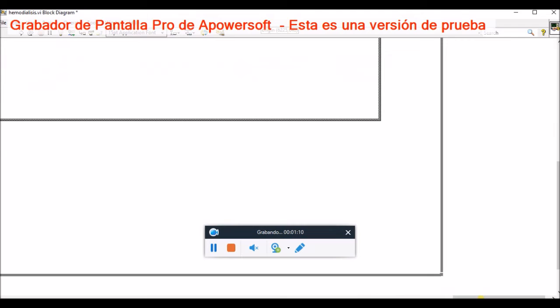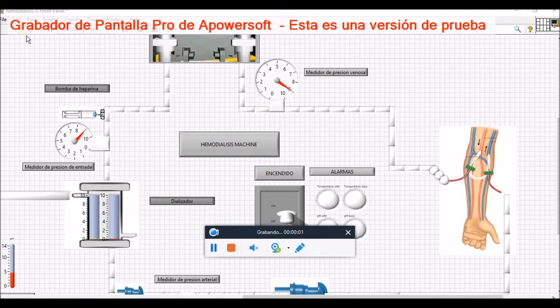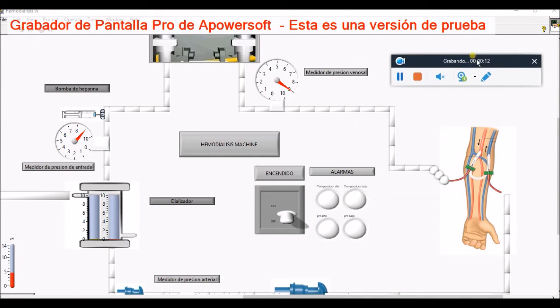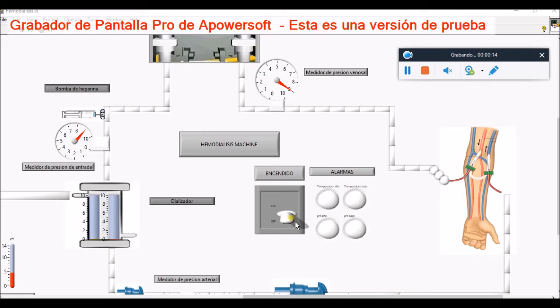Pressure sensors monitor the pre- and post-filter pressures. Adequate pressure must be maintained in the circuit to promote ultrafiltration and prevent clotting. The system will alarm if the pressure is too low or too high. Low and high pressure can indicate complications such as a clot in the filter or an occlusion in the catheter.